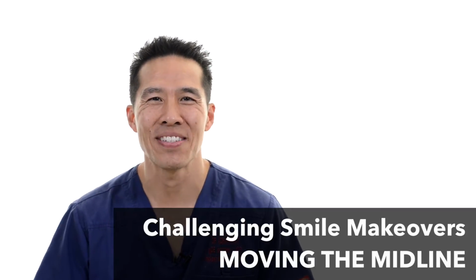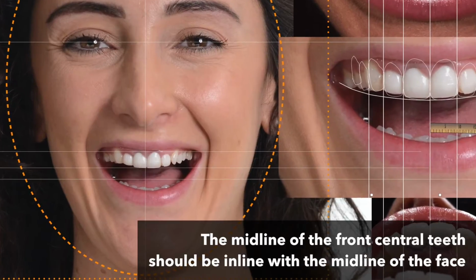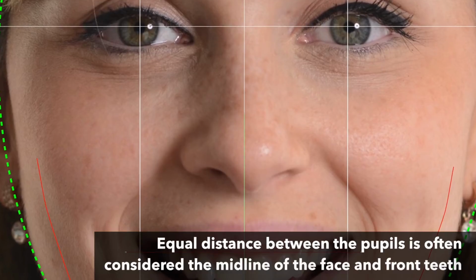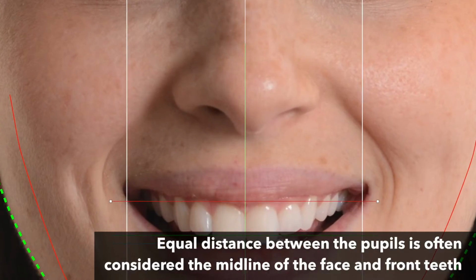Moving the midline. Well, when we look at symmetry and digital smile design, one of the things we try and do is get the position of the front teeth in line with the midline of the face. So when we look at smile design and DSD, we can see that if we draw a line from pupil to pupil and draw a line in the middle of this, this is usually the middle of the face and it's usually the middle of the two front teeth.